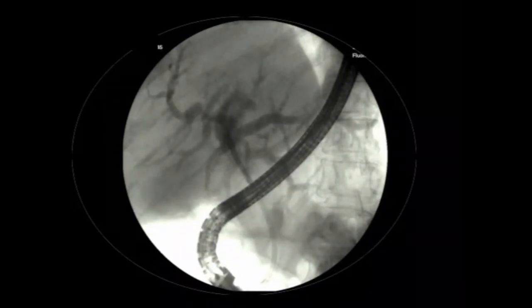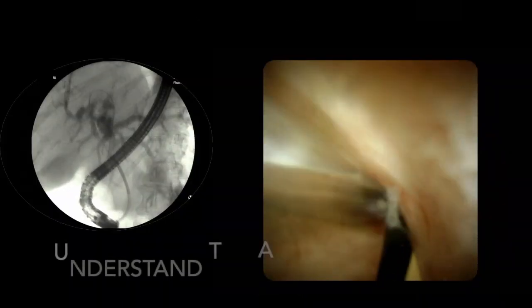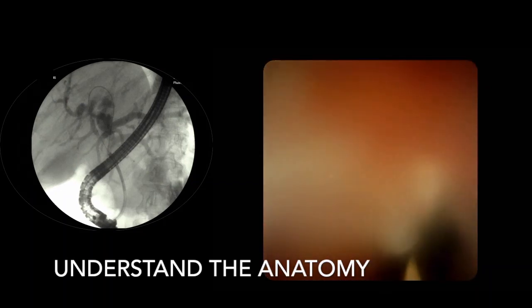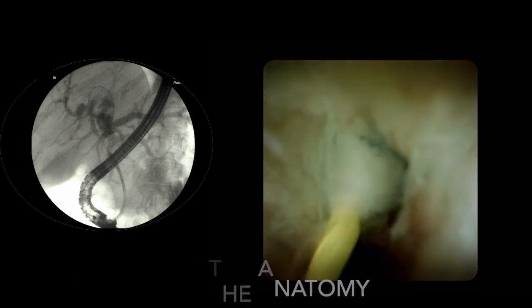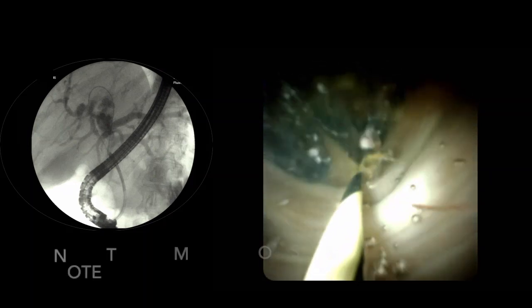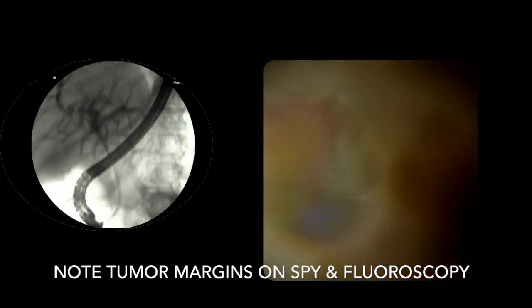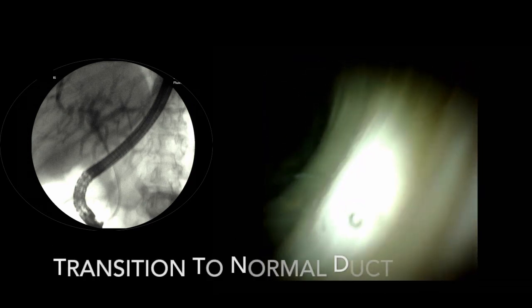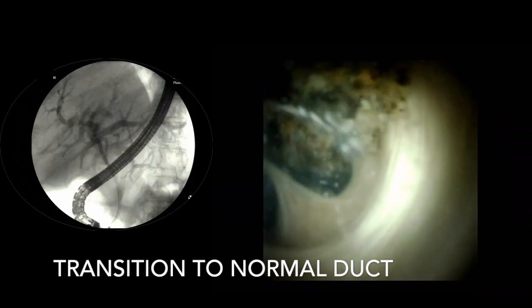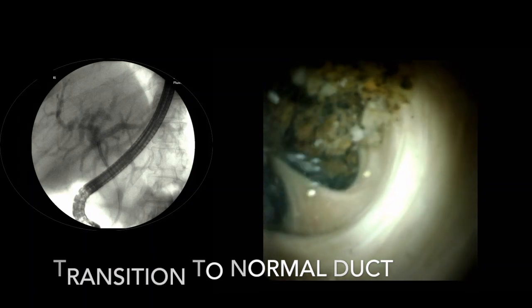The endoscopist is following both fluoroscopy and endoscopy, and most importantly the SpyGlass image — three images which we pay attention to during cholangioscopy. It is very key to understand the anatomy of the biliary system. On the fluoroscopic image on the left, you can see where the tumor begins and ends. The endoscopist must identify the margins of the tumor on SpyGlass and fluoroscopy, then correlate them to fluoroscopic markers. Here you can see transition to normal duct, which is the proximal extent of the tumor. The distal extent is at the level of the ERCP scope.